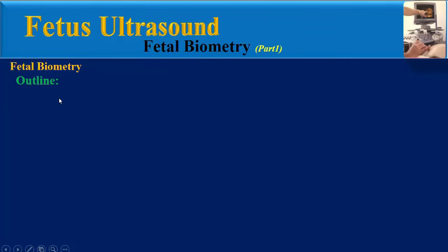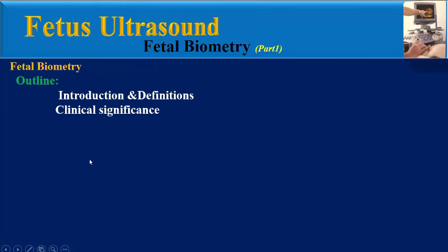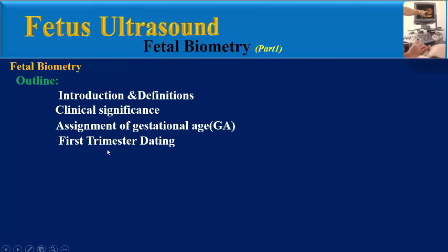What is the outline of this presentation? The first, introduction and definitions, clinical significance of fetal biometry, assignment of gestational age, first trimester dating, and final teaching points. The first, introduction and definitions.